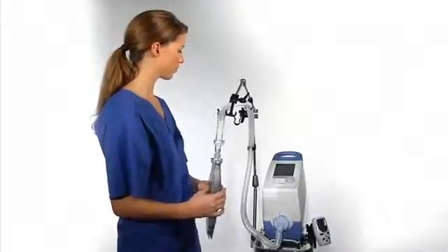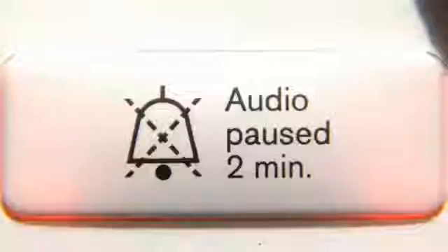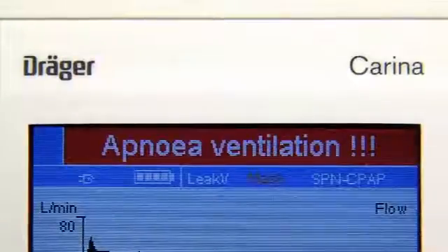Now mimic a spontaneously breathing patient by pressing the test lung. When you stop spontaneous breathing, the alarm apnea ventilation will appear after 5 seconds and the apnea ventilation will begin.